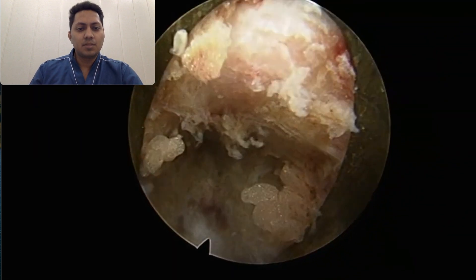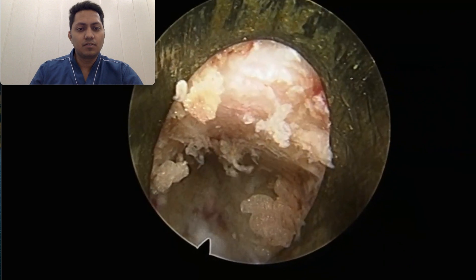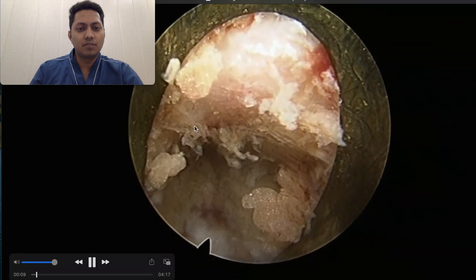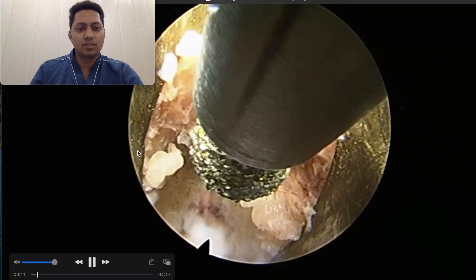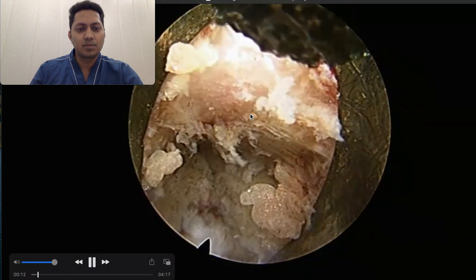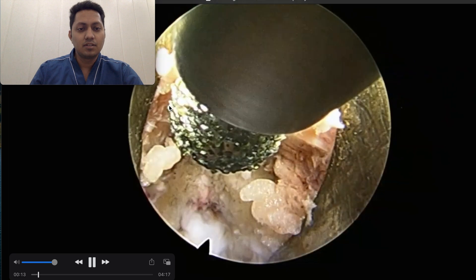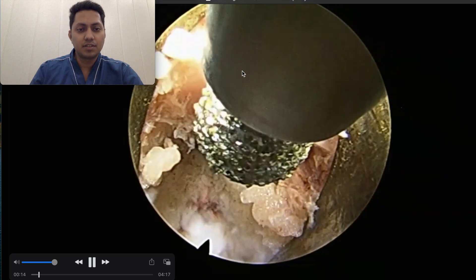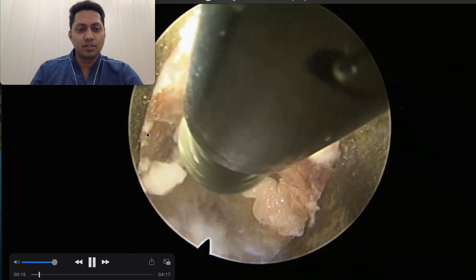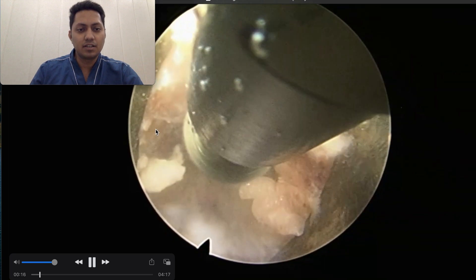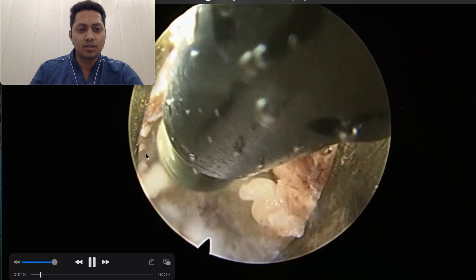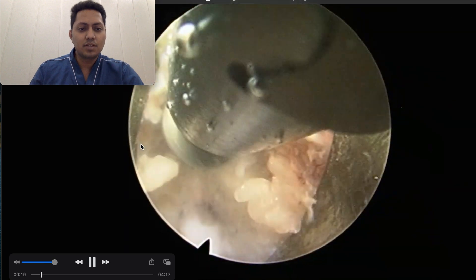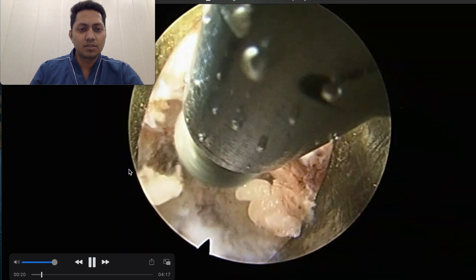We have just come out from the foramintomy and what we are seeing now — this part is the superior articular process, the ascending facet joint, and this is what we call the Wagner arch. We start our work from this region.